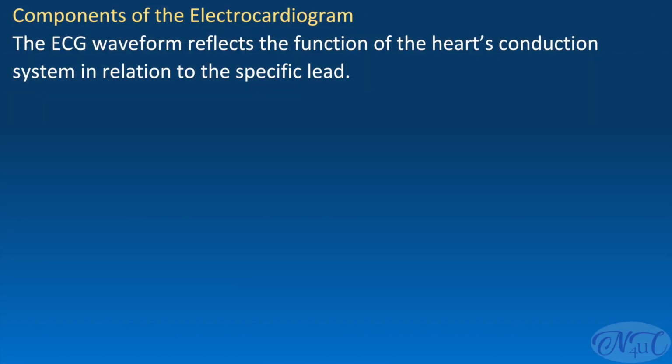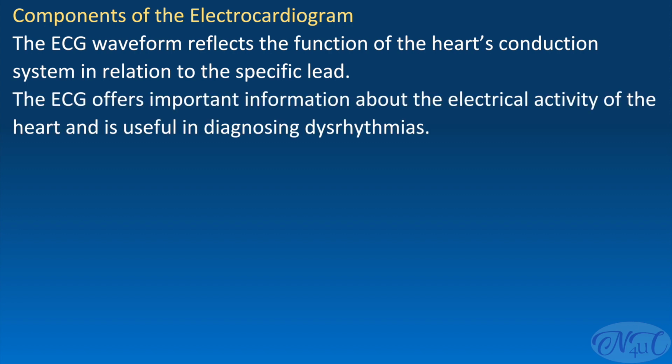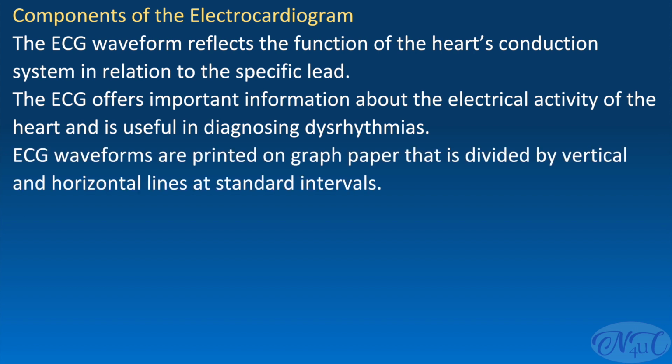Now let us see components of electrocardiogram. The ECG waveform reflects the function of the heart's conduction system in relation to the specific lead. The ECG offers important information about the electrical activity of the heart and is useful in diagnosing dysrhythmias. ECG waveforms are printed on graph paper that is divided by vertical and horizontal lines at standard intervals.